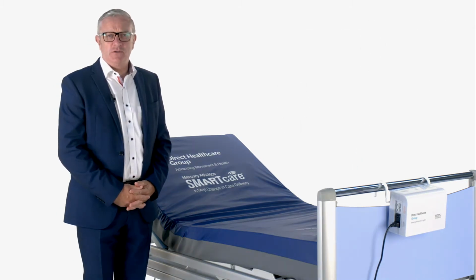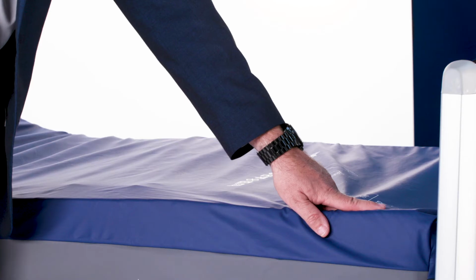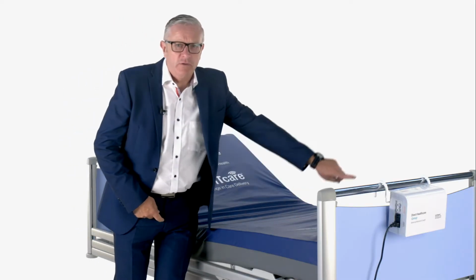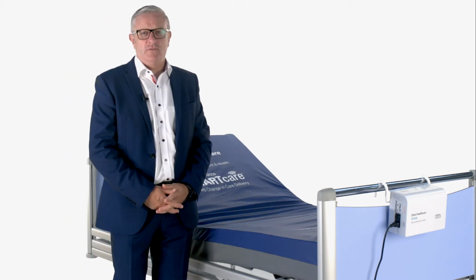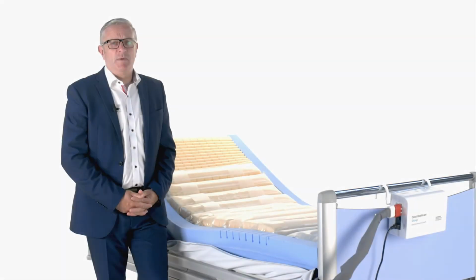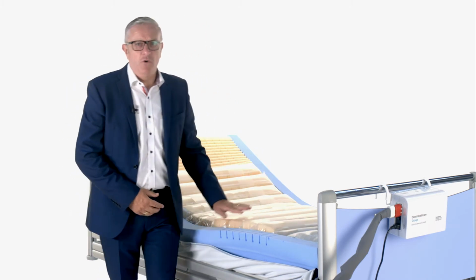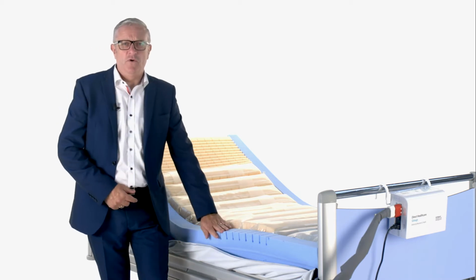To access the mattress, the zip is located at the bottom left-hand side when looking at the mattress from the footing of the bed. The zip runs around the three sides of the mattress and can be opened to enable access to the inside of the mattress. Inside the mattress you will find a series of air-only cells, a series of foam and air cells, a static foam head section and the blue foam U-core.